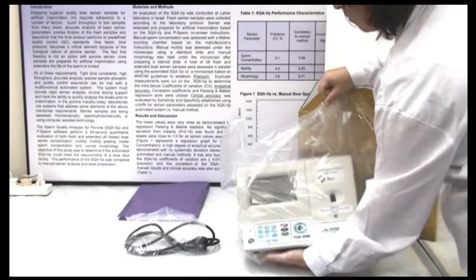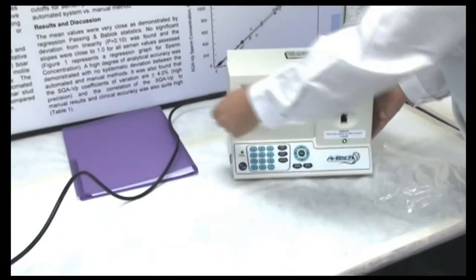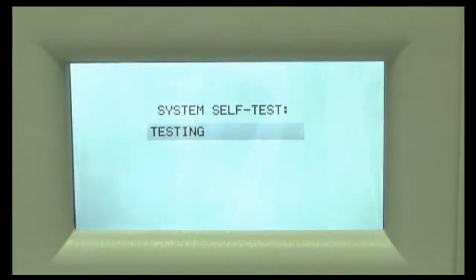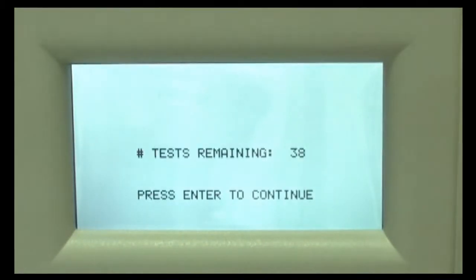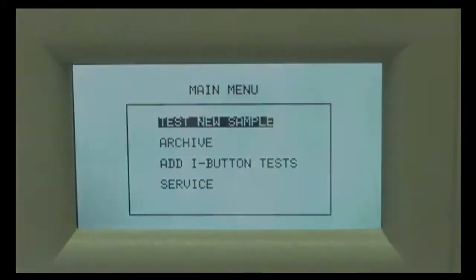To power up the system, plug in the supplied power cord. We strongly recommend using a surge protector. Turn the system on from the rear panel and from the front keypad and allow approximately 5 minutes for a one-time auto-calibration and self-test. No calibration is ever required by the operator. The system will then indicate the number of I-button tests remaining and advance you to the main menu. We will return to system operation in a moment.